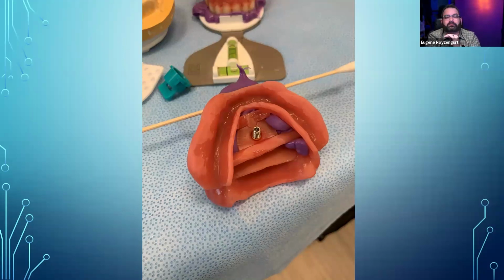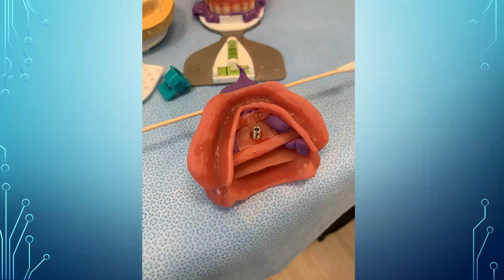Now, if you want to skip a bunch of steps, I guess you can technically do two appointments, but in my personal and professional opinion, you cannot create a good quality denture, because patients tend to bite differently every single time. Occlusion can change. Aesthetics, the patient will say, "Oh yeah, I don't care about aesthetics. Things are fine," and then you get things processed and delivered at the next appointment.